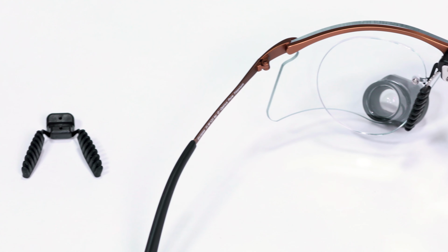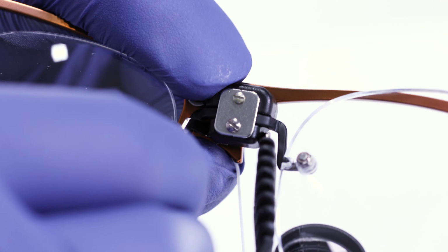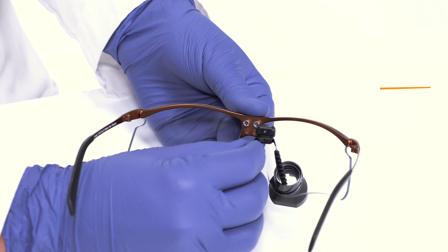Loupes offer flexibility to choose whether you are wearing prescription lenses or contacts. When wearing contacts, remove the prescription insert and slide in the quick disconnect Nosepad in the same manner as you would add your insert.